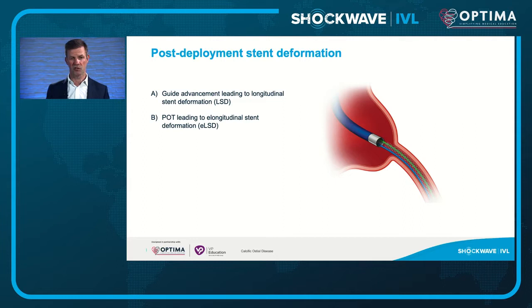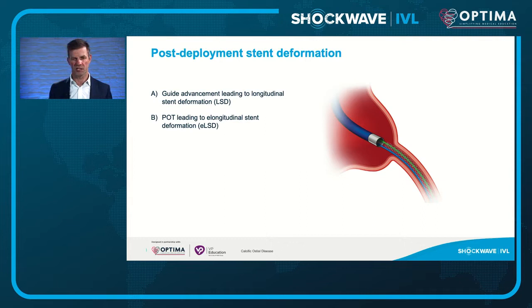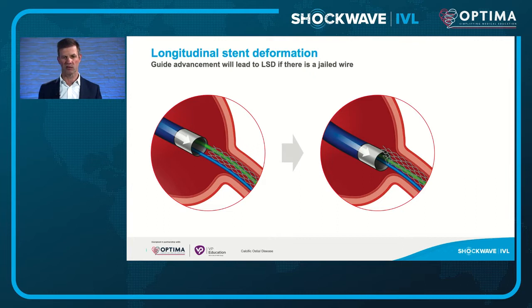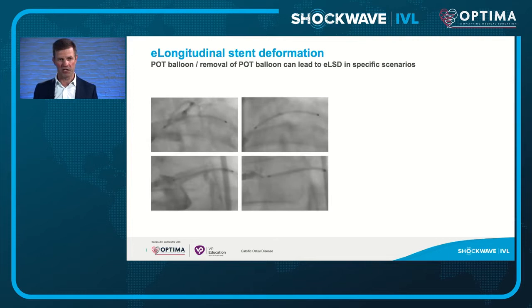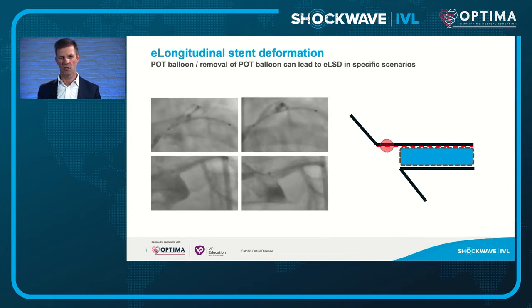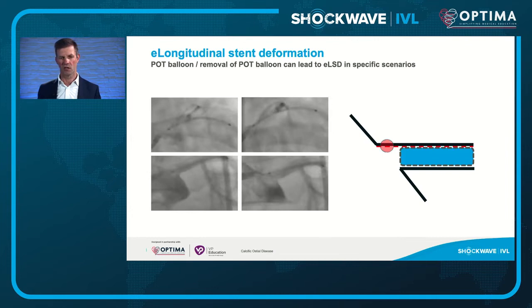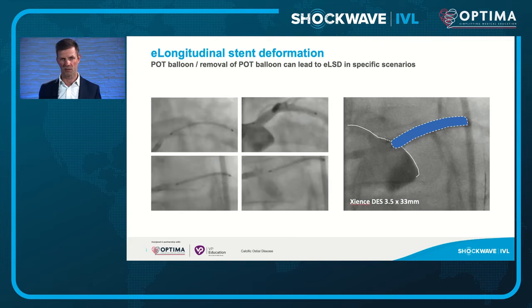When deploying stents, using two wires can commonly cause longitudinal stent deformation. With more imaging and stent length measurement, we're seeing elongation of stents with POT. In a left main example with two wires deployed on one and a jailed circumflex, pulling that out can deform and compress the aorto-ostium. Here you can see a left main LAD stent being deployed carefully, targeting the aorto-osteal landing zone — a 3.5 by 33 millimeter stent.